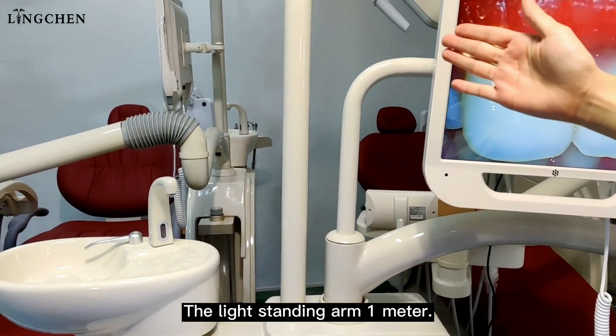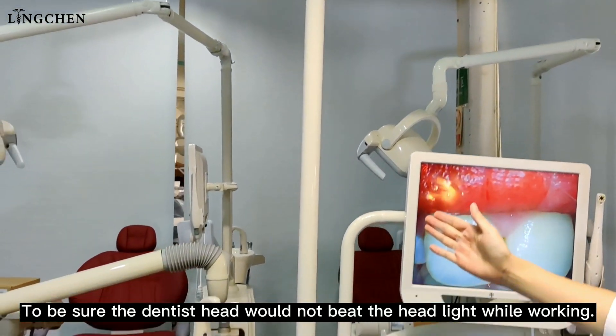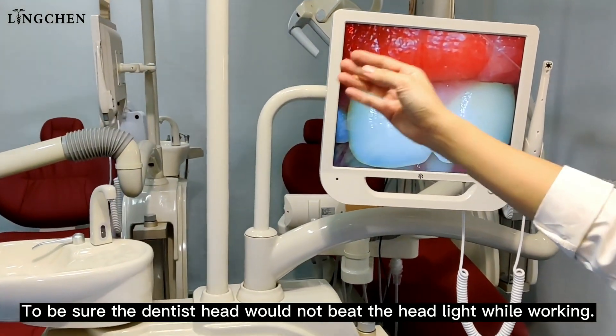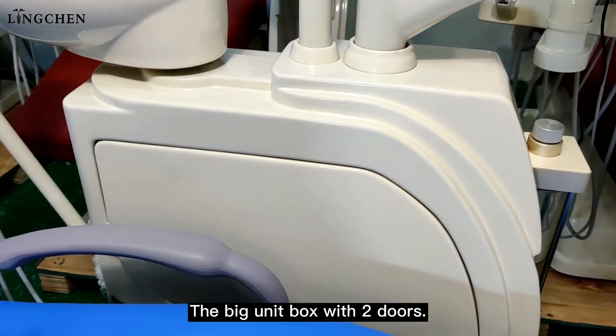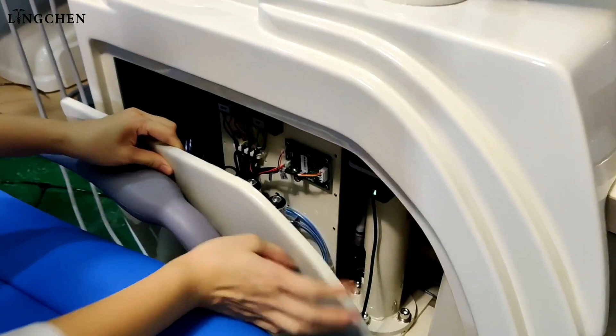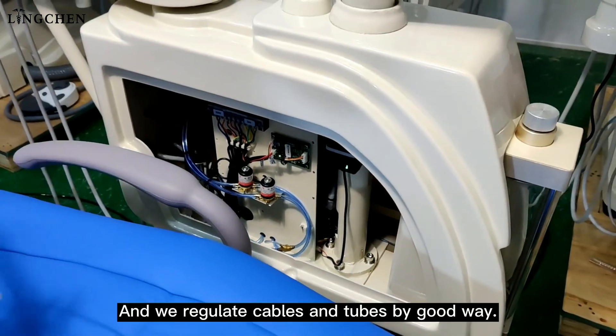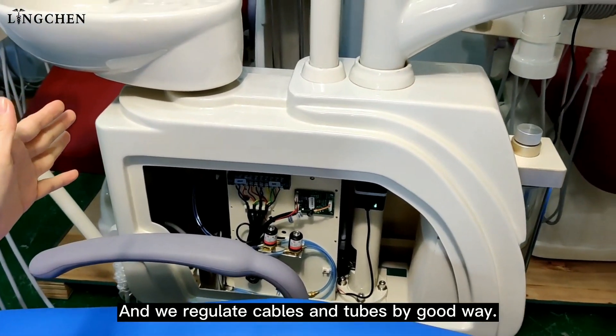The light standing arm is one meter long to ensure the dentist's head will not hit the headlight while working. The big unit box has two doors.